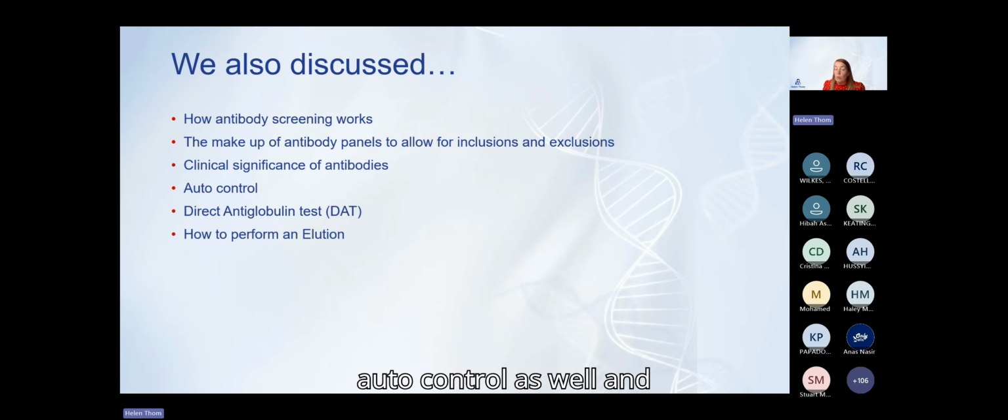And we talked about an auto control as well, and how that would link when you're talking about your direct antiglobulin test. We also covered how to perform an elution. So I went through that hopefully to help you understand that when you are performing an elution, this is on a patient who has been recently transfused.